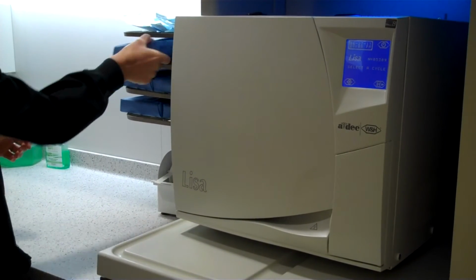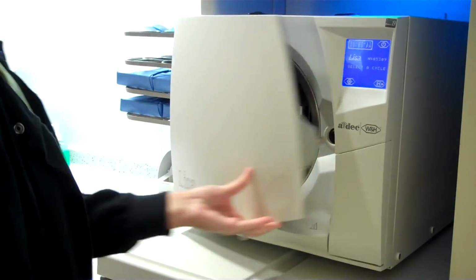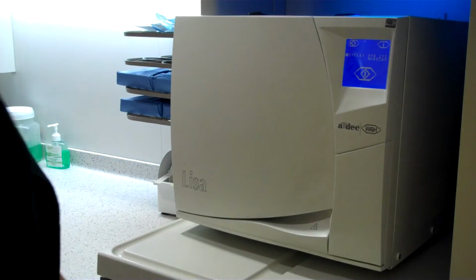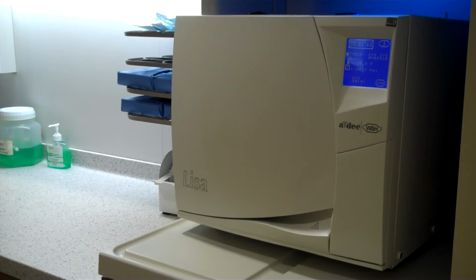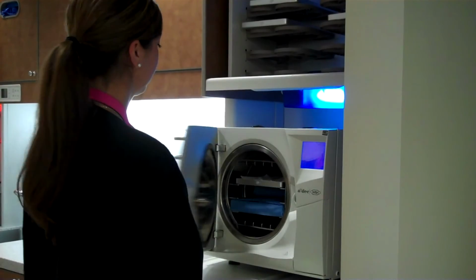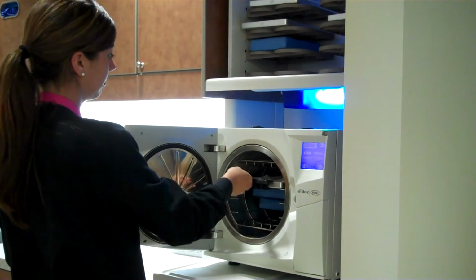Instruments are heated in our sterilizer to approximately 275 degrees Fahrenheit at a pressure of 33 pounds per square inch for about 40 minutes. The sterilizer is kept in good working order with regular maintenance, and testing is done on a regular basis to ensure that it is functioning properly. At the end of the sterilizer cycle, the instruments are removed and placed in the clean cabinet to cool. Once the instruments are cool, they are ready to be used to treat your smile.